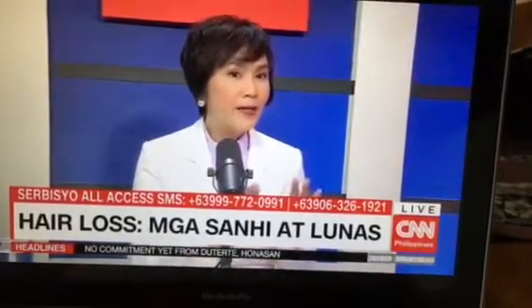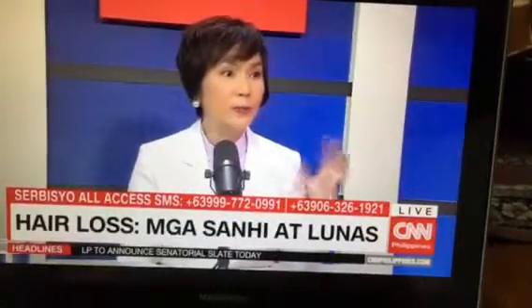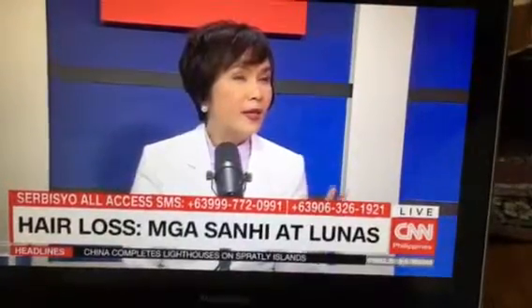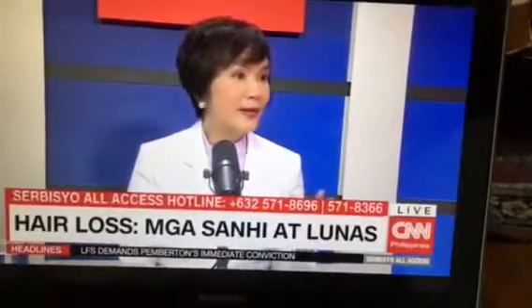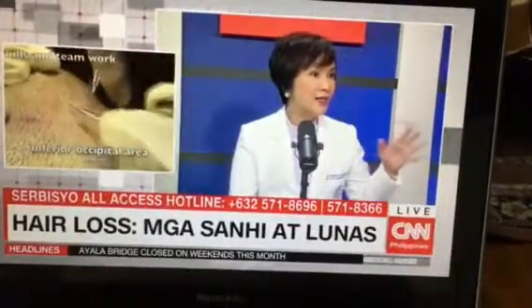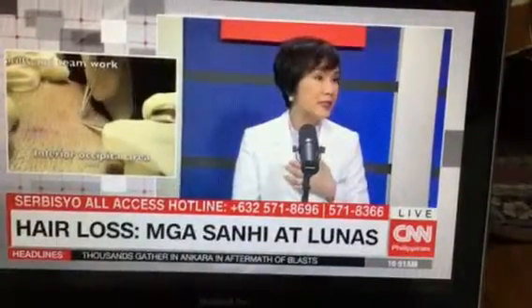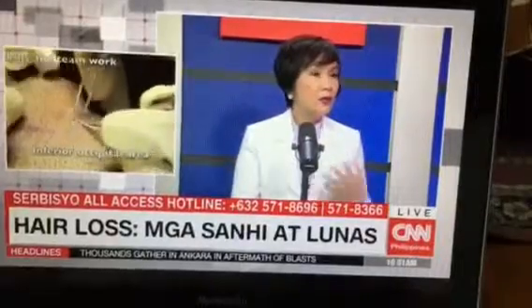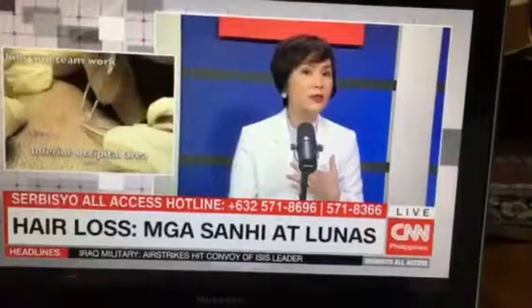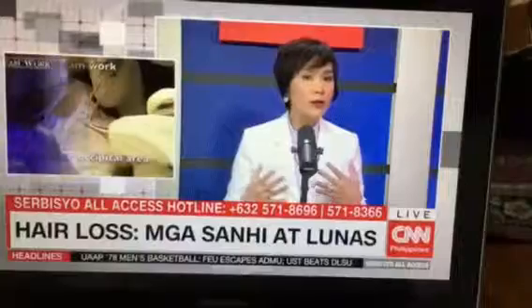So parang yung robotic eliminates one of the difficult parts of the procedure, but yung result ng procedure does not depend on the robot. It's the whole procedure which is dependent on the knowledge of the physician and the skills of the physician, and how well you do it together with your well-trained surgical team, because it's a procedure that cannot be done alone by the physician. Kailangan meron kang group.